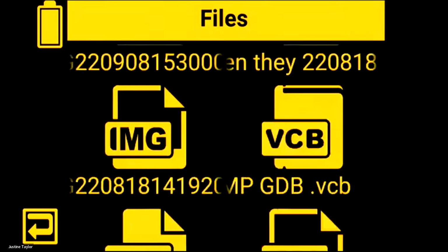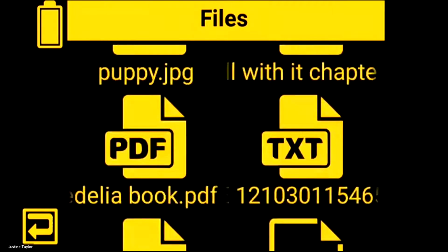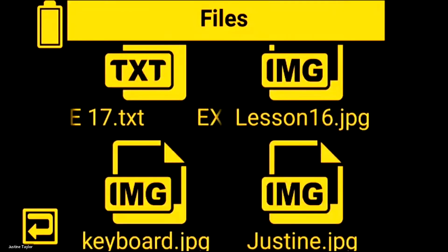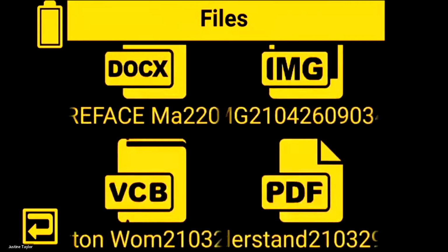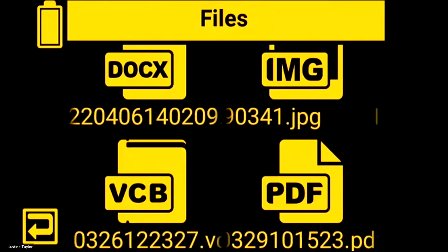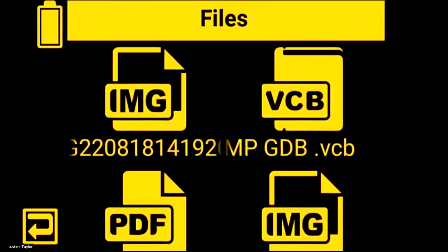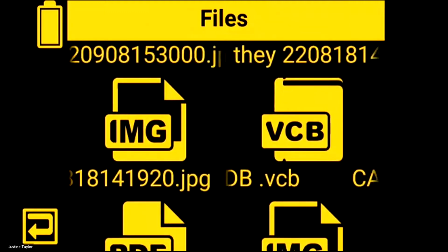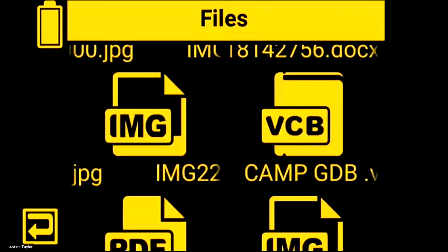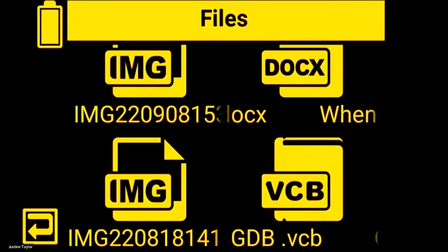And this is where I have a bunch of files on here. You can see how many files. We will specifically dive deeper into this topic for our next webinar, and we'll talk about all the different file types and how to transfer files. But you can see some of these have file names saved to them from the computer, and some of them, like the ones we just did today, are audio tagged.